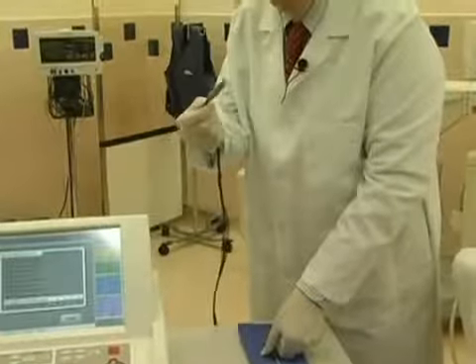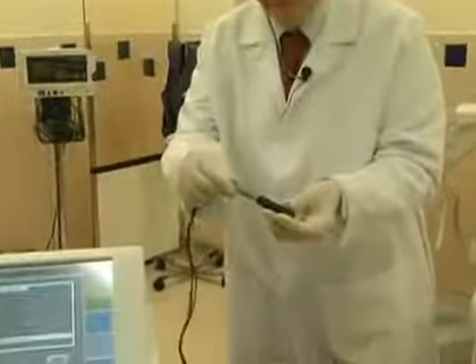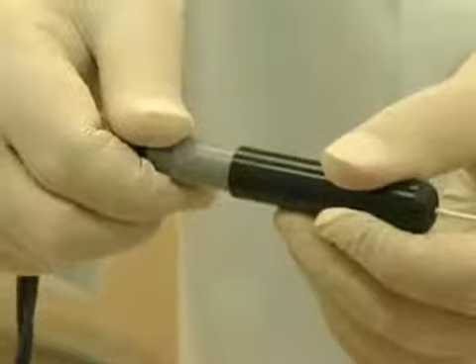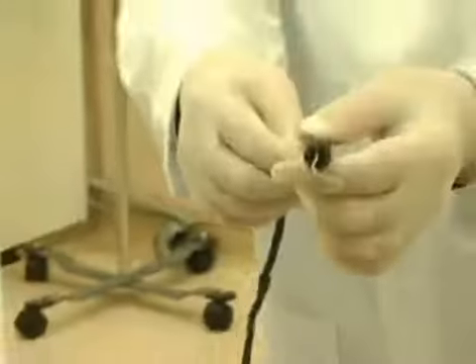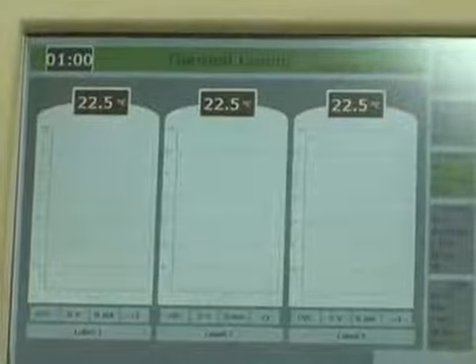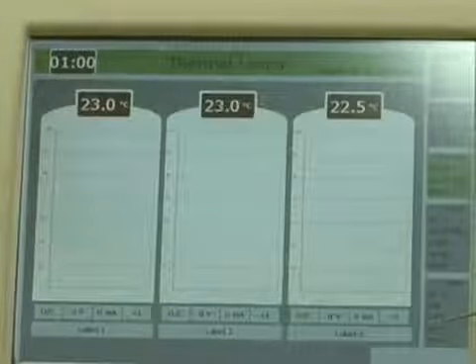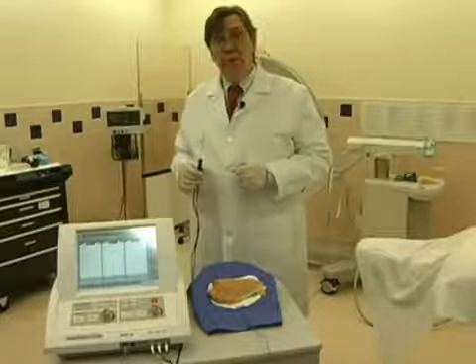The other end of the cable has a gray connector. This gray connector goes into the Simplicity probe, which has now been correctly placed under fluoroscopy into the patient. The gray connector is simply placed up to the Simplicity probe and rotated until the keys align. A light push then locks the cable into the Simplicity probe with an audible click. Now that the probe is connected, we can see that there are 3 temperatures being measured on the NT1100. These 3 temperatures correspond to the 3 active areas on the Simplicity probe: the distal probe, the medial probe, and the proximal probe. I'm now going to do a simulation of an ablation using the Simplicity system.